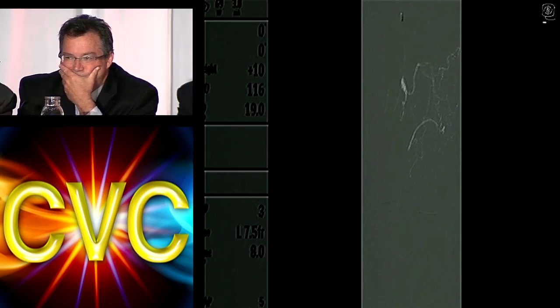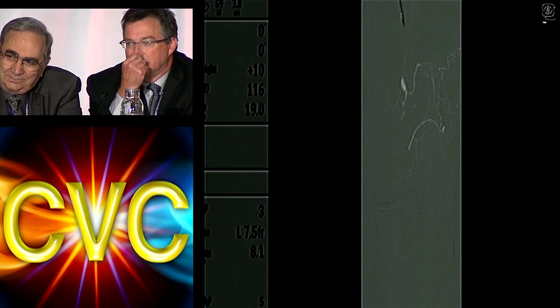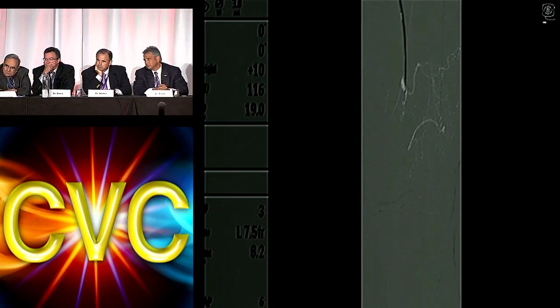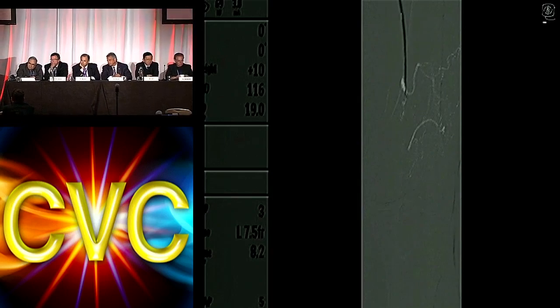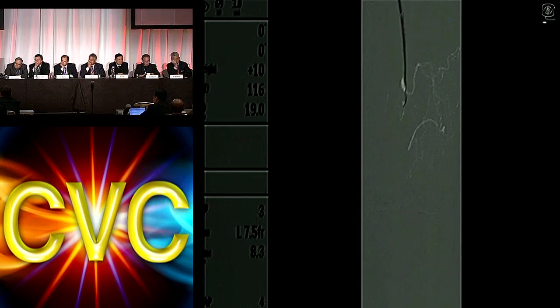And which one do you advise? That's a possibility. We do see a small lumen. It's quite serpiginous here, but we're going to see if we can traverse it. Do you have a torquer? It keeps wanting to go the wrong way. Our plan was, if we could get across this cleanly, we really did want to IVUS it to get an idea of what's left and what it looks like.